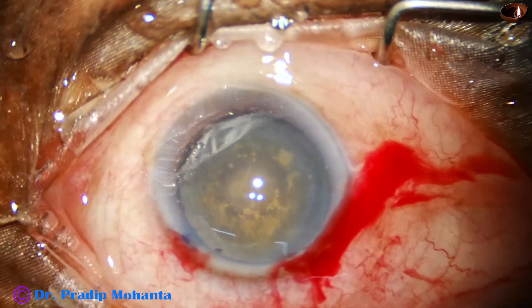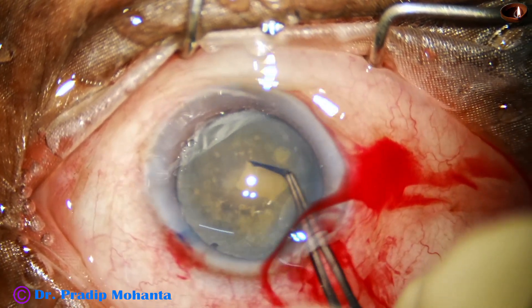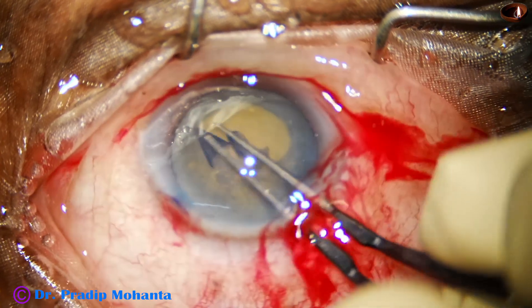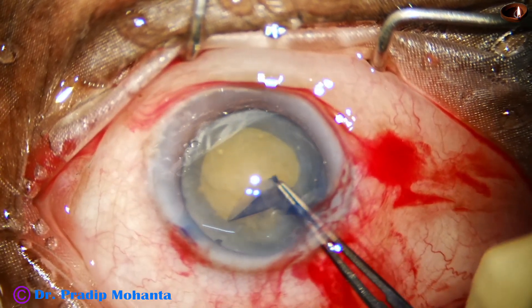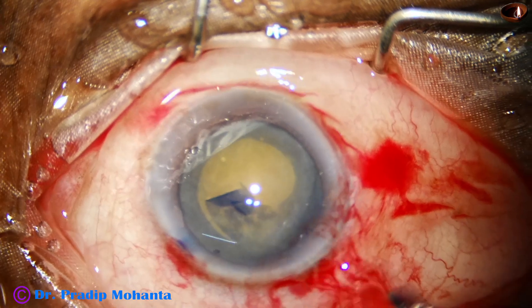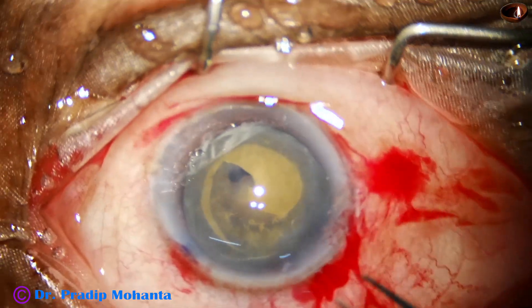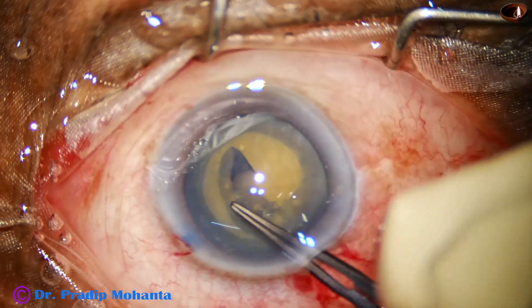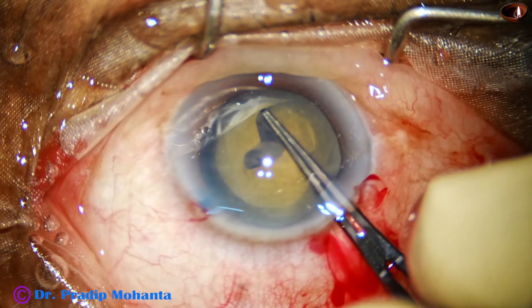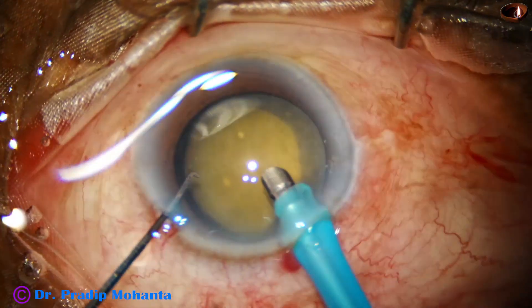In this case, I am going to do the rhexis very carefully with very gentle pull so that I do not cause zonular tear during the rhexis. I am not planning a large rhexis either, because if the tag goes into the zonular attachment area, it will be very tough to prevent zonular detachment. The idea is to flip this capsular tag and gently do the rhexis. I have got a nice rhexis about 5 millimeters in diameter, and now is the time to manage the nucleus.